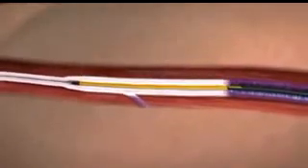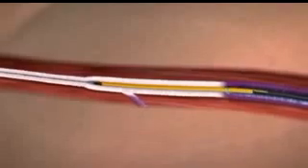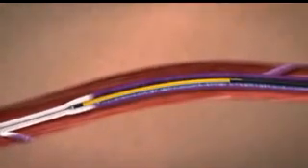After each segment treatment is complete, the Closure Fast Catheter is repositioned to the adjacent vein segment for treatment.